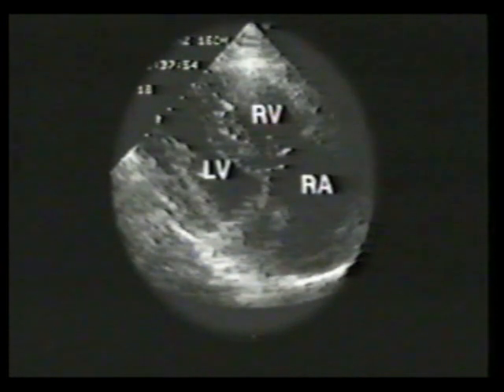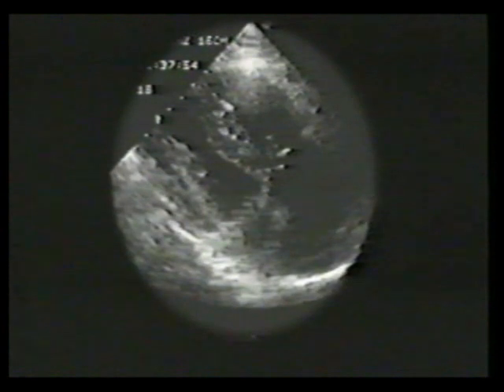This patient had experienced sudden onset of dyspnea, and a new murmur had been discovered. This small, sac-like echo appears to be attached to the septal tricuspid leaflet, but is actually the windsock from a ruptured aneurysm of the right coronary sinus of Valsalva.